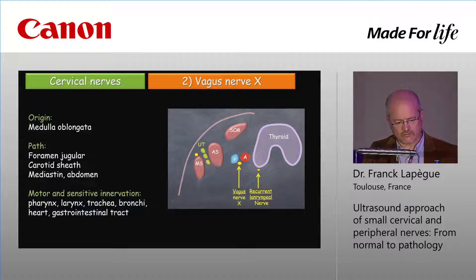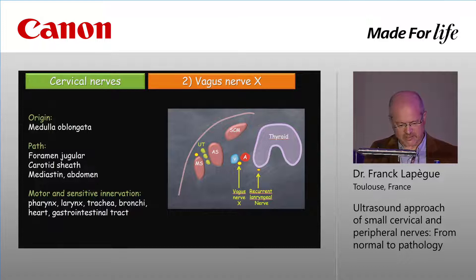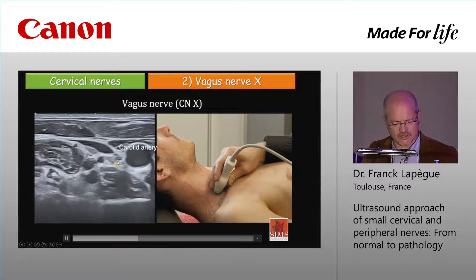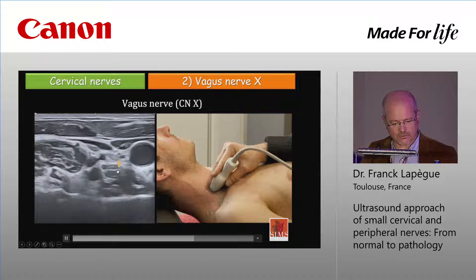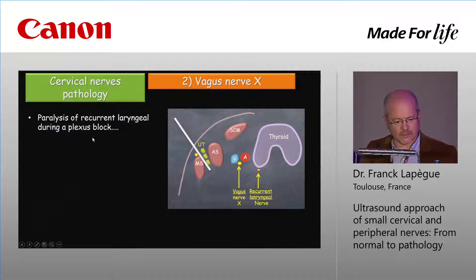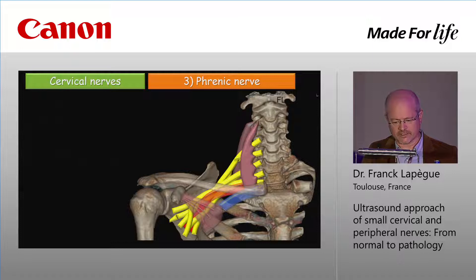The second nerve is the vagus nerve. It comes from the medulla oblongata, crosses the jugular foramen, and then travels inside the carotid sheath. Then it travels in the mediastinum and gives a small recurrent branch — the recurrent laryngeal nerve — then it reaches the abdomen. It provides motor and sensitive innervation for the pharynx, larynx, trachea, bronchi, heart, and gastrointestinal tract. In this demonstration: the two landmarks are the jugular vein and the carotid artery, and the nerve is right here in short axis axial view. I tilt the probe to show you the long axis of this nerve — it's quite easy to see. During plexus block, you can observe paralysis of the recurrent laryngeal nerve caused by diffusion of anesthesia.